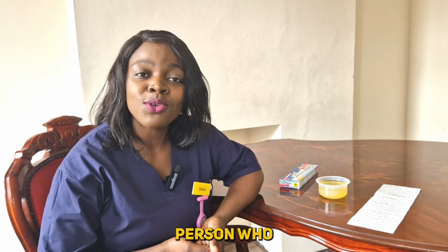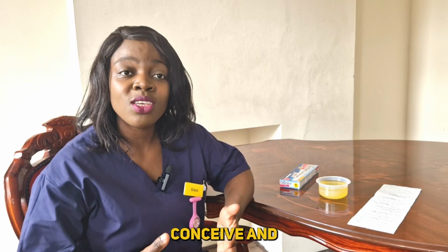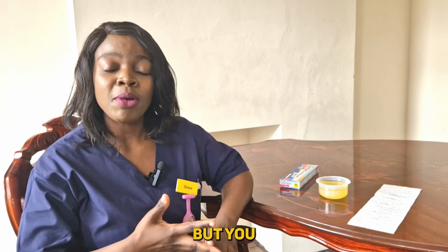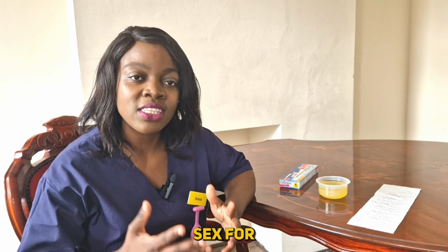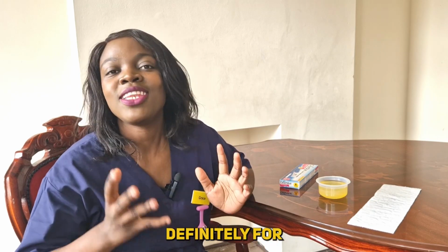So if you're that person who has just missed her period, or if you're that person who is trying to conceive and you haven't seen your period yet, but you know that you've been having unprotected sex for quite some time now, then this video is definitely for you.